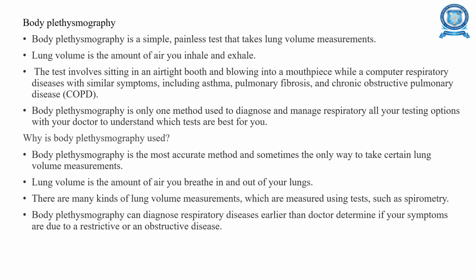Next is body plethysmography. It is a simple, painless test that takes lung volume measurements. That is, the lung volume is the amount of air you inhale and exhale. Body plethysmography is one method used to diagnose and manage respiratory conditions; discuss your testing options with your doctor. Why is body plethysmography used? It is a more accurate method. Sometimes it is the only way to take certain lung volume measurements. There are many kinds of lung volume measurements which are measured using tests such as spirometry.